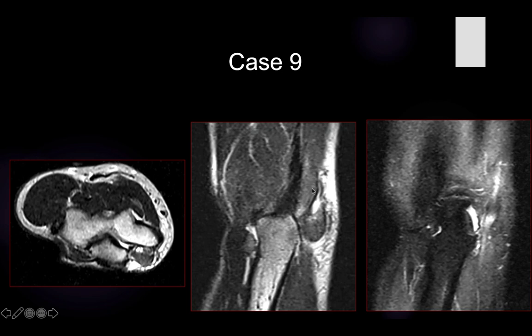And if we see here, this is the triceps, and this is the abnormal muscle. This is a typical example of the accessory anconeus muscle. Actually, this is an example of ulnar neuropathy secondary to the presence of an accessory anconeus muscle. This is one of the important roles of radiology in ulnar neuropathy, because ulnar neuropathy is usually clinically diagnosed, and they send the patient for detection of any underlying causes that can cause this ulnar neuropathy. In this patient, the cause here is the accessory anconeus muscle.